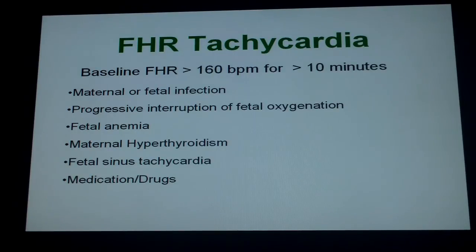Baseline fetal heart rate, by definition for tachycardia, is 160 beats per minute for greater than 10 minutes. And you all know already about maternal or fetal infection. If there's a temp, and even if there's not a temp or just a low-grade temp, that can cause a definite rise in fetal heart rate. If a baby has progressive and continued interruption of fetal oxygenation, where there are too many contractions, a lot going on, you can see those rising baselines where you get some tachycardia.